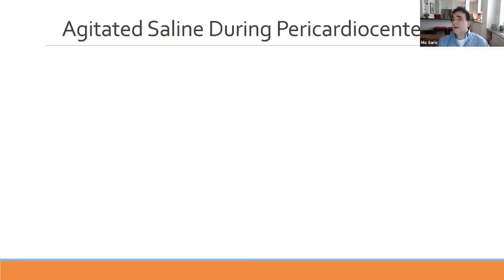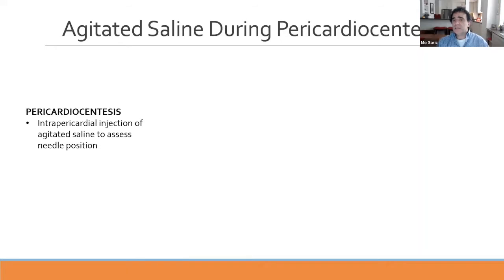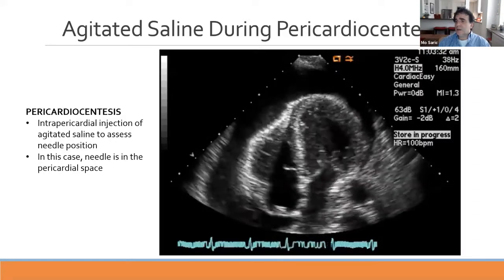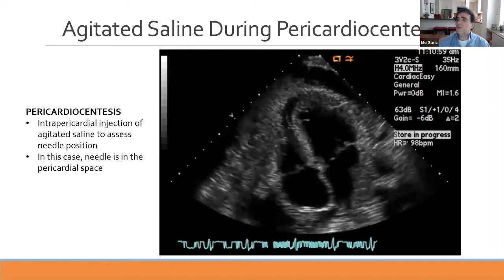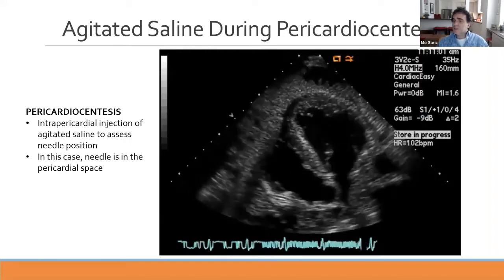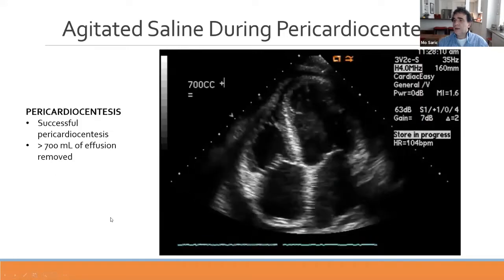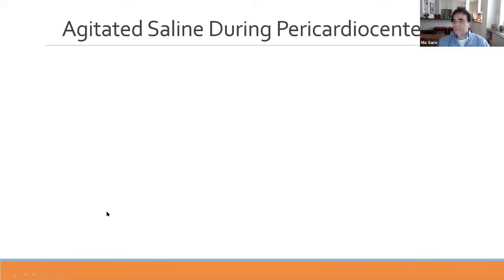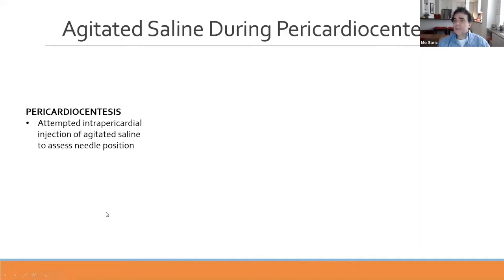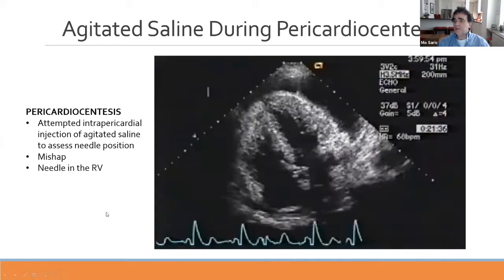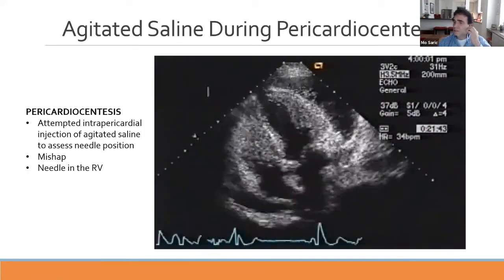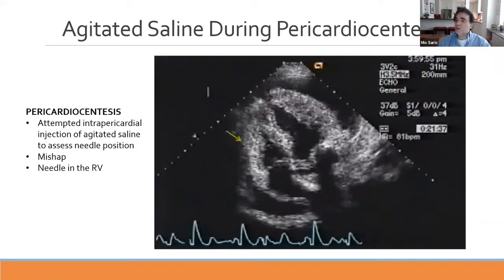Another use of agitated saline is during pericardiocentesis—intrapericardial injection to confirm needle position. In one case, agitated saline is injected and we confirm the needle is in the pericardial space, allowing safe withdrawal; 700 cc was removed and the patient improved. A contrasting example shows a mishap where the needle entered the right ventricle instead, demonstrated by opacification of the right ventricle, necessitating open-heart surgery.